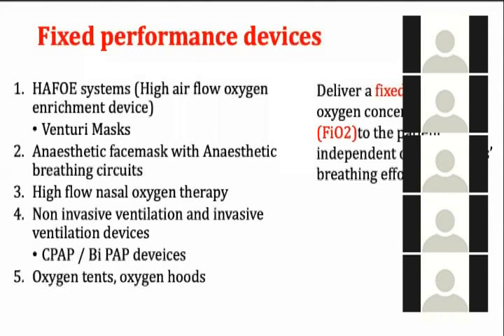The patient's tidal volume is about 500, but this is the rate at which the patient takes gases, I'm talking. Okay. So if you're giving the patient, just say, 5 liters per minute for ease of calculation, and the patient takes more than that, the rest of the gases should come from the air, isn't it?